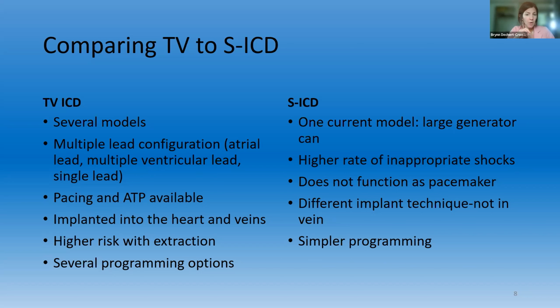There can be a higher rate of inappropriate shocks, and that means you are getting shocked for a rhythm that doesn't need to be shocked. And so in children especially, we found that there can be a higher rate of inappropriate shock with subcutaneous ICDs. Like I said, it does not function as a pacemaker. So if you need pacing, this is probably not the device for you.